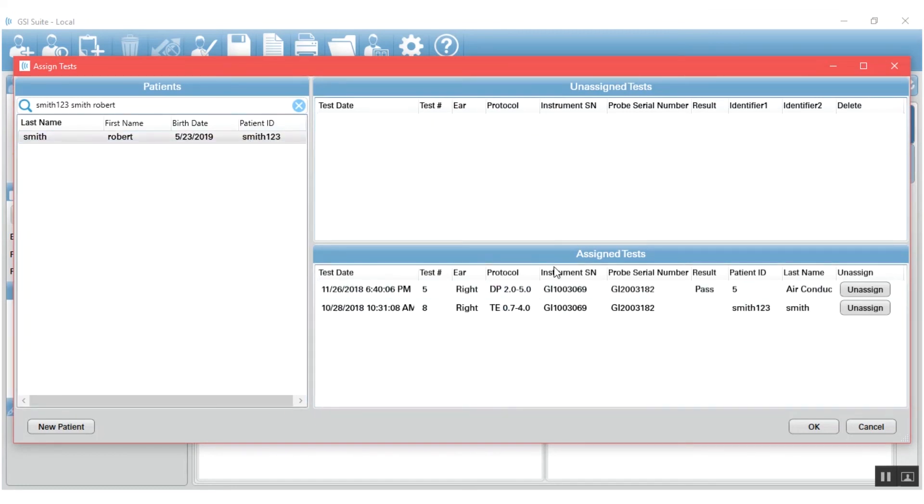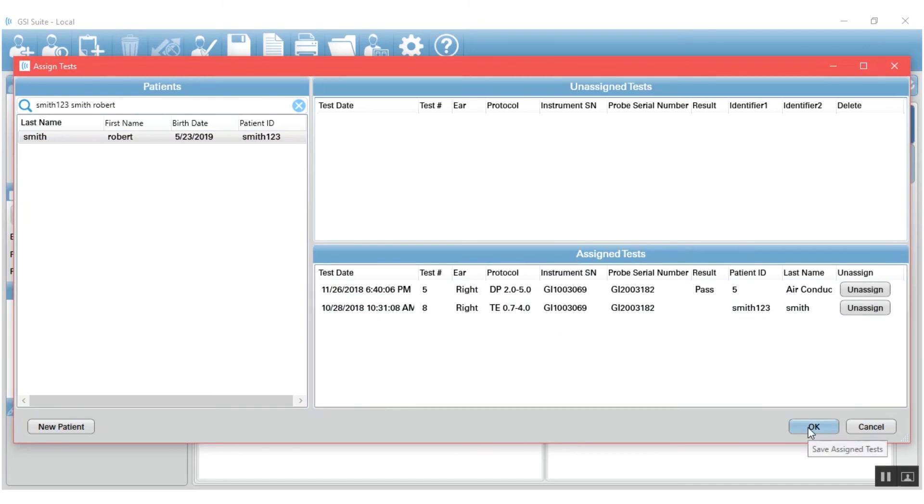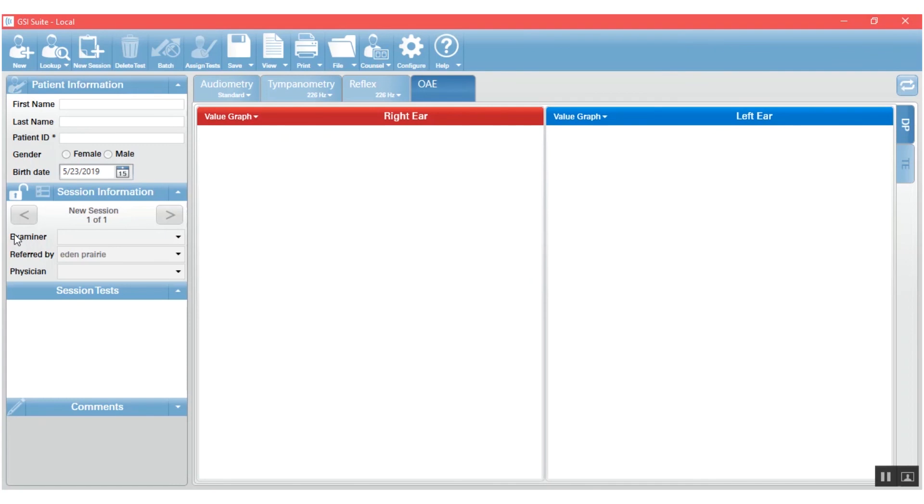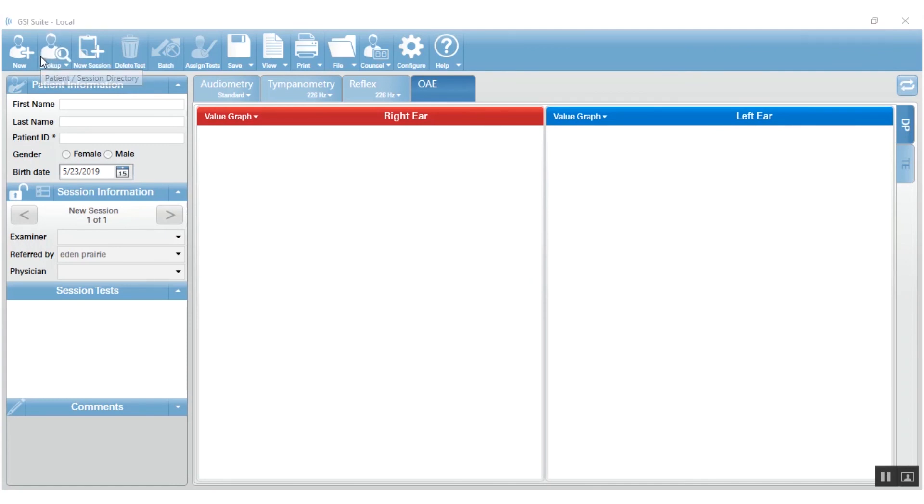When you have assigned the tests and all of your results appear in the assigned test window, press OK. The assigned tests are saved and now they will be able to be viewed when you look up your patient information.